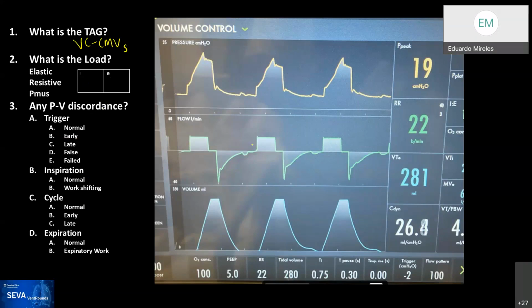Can you comment on the expiratory limb? Does that look like elastic too? Yeah, I think so, but there is a negative flow just after that. So I wonder, this little thingy, that means the patient at that time is breathing out a little bit more. I don't think this is auto-PEEP. But you see this little thingy. So you think that this is elastic during inspiration and expiration?